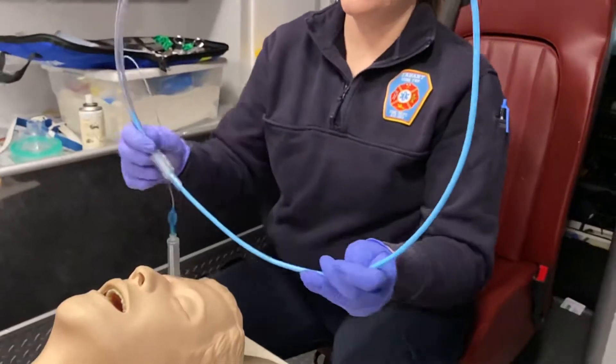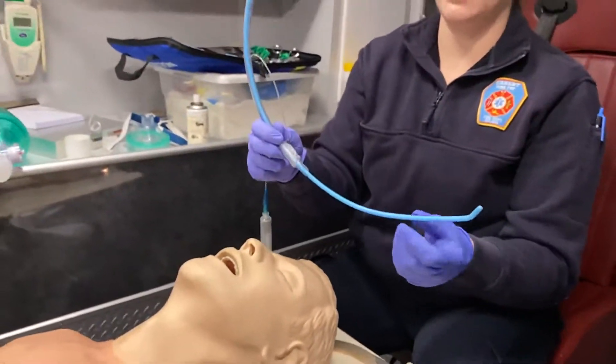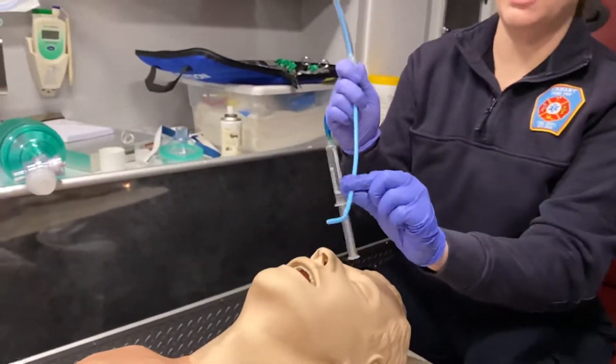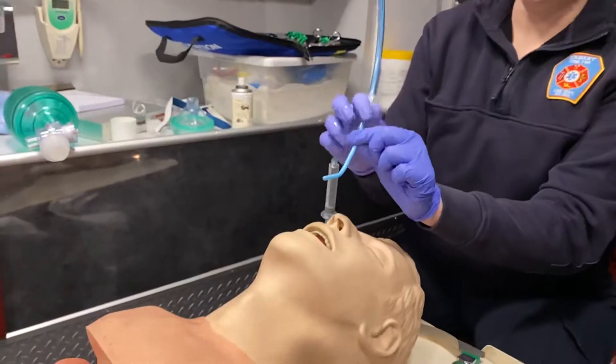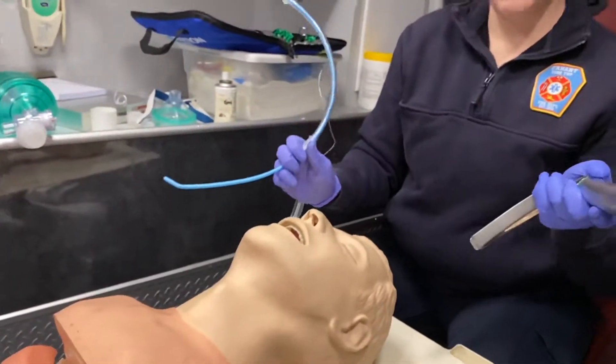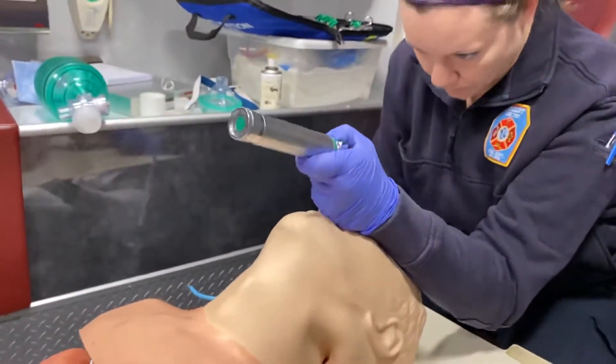You're going to put the ET tube over the end of the gum bougie, just like if it was a stylet. We're actually going to use this and introduce it into the glottic opening, and then we can slide our tube down over it. Just like a regular intubation, I'm going to go in with my laryngoscope.